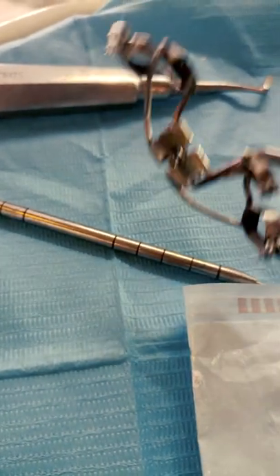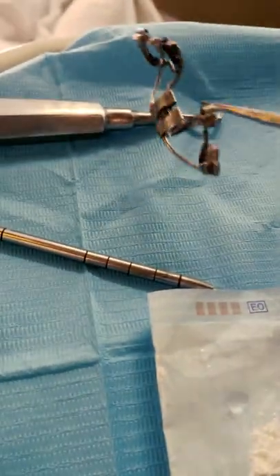Hyrex is the appliance used for palatal expansion as a means of expanding a constricted palate.